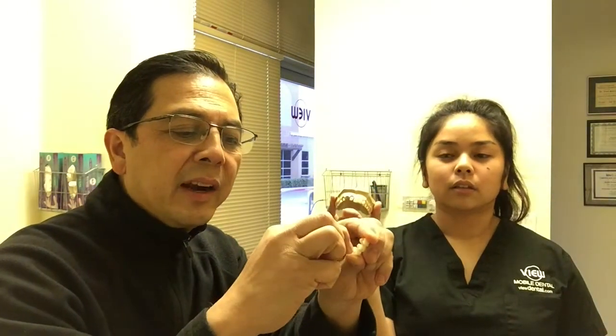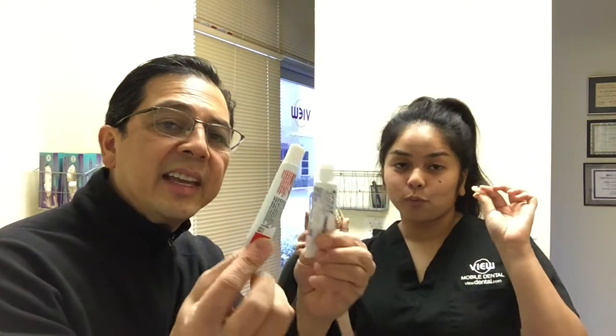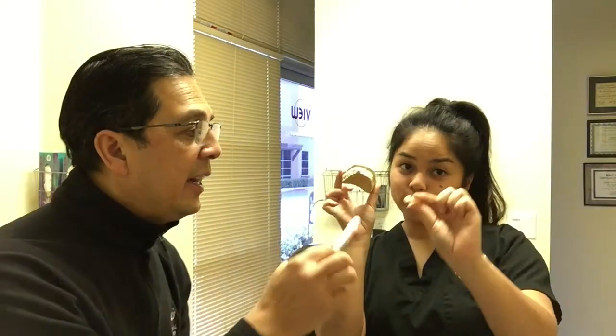And then you want to make sure that it's clean enough so you could put the bridge right back. It'll be loose because there's nothing in there to keep the bridge in. So once you've cleaned this off with a Q-tip or a toothpick, and you've got to make sure it's clean, you can use either a toothpaste or a denture paste as a temporary cement.